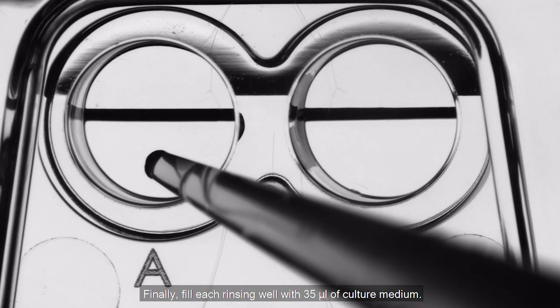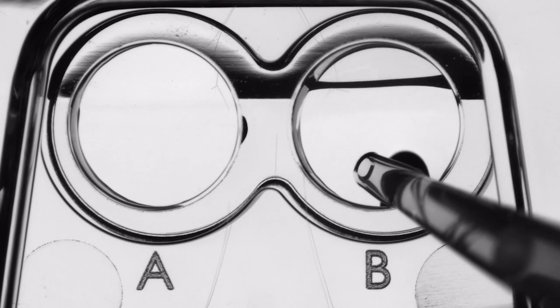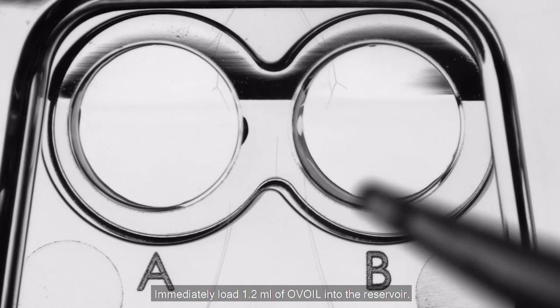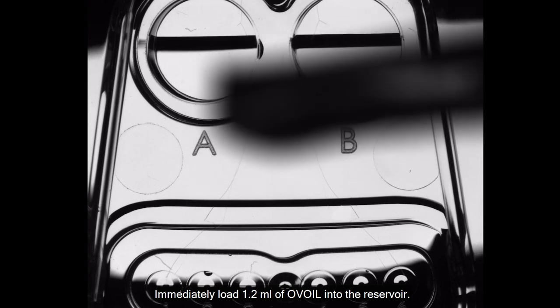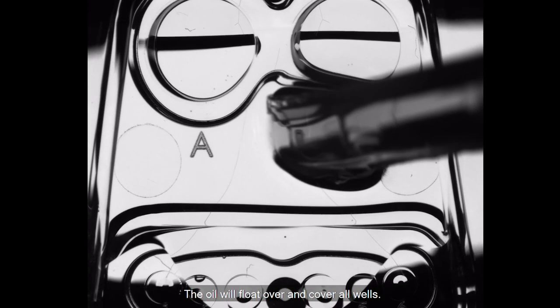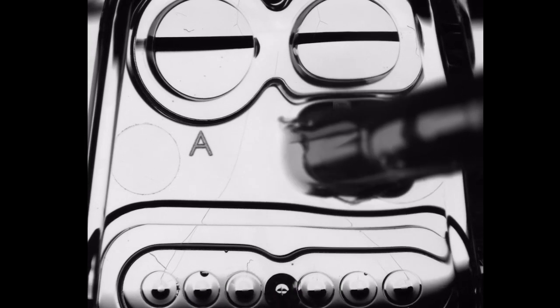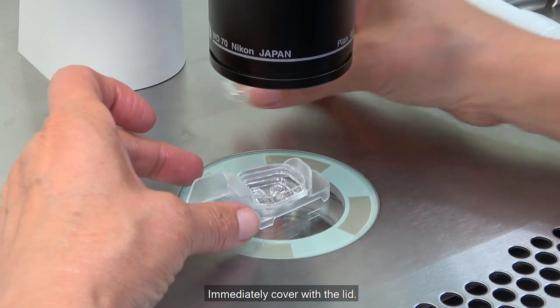Finally, fill each rinsing well with 35 microlitres of culture medium. Immediately load 1.2 ml of OVOIL into the reservoir. The oil will float over and cover all wells. Immediately cover with the lid.